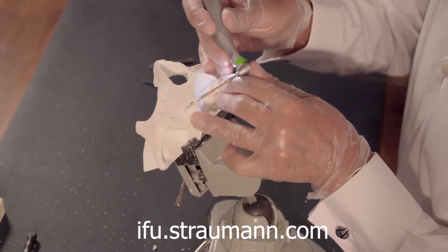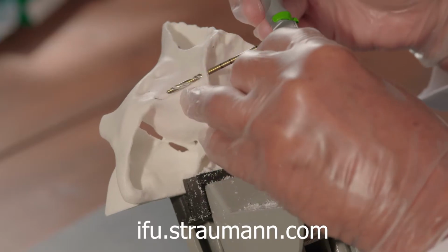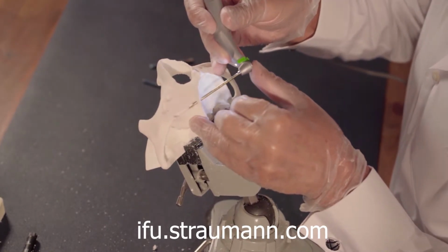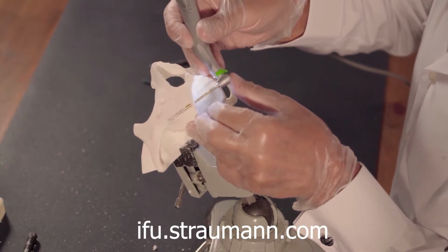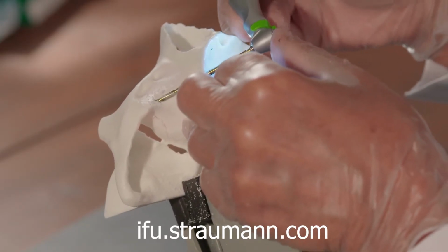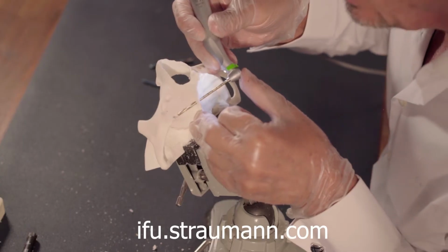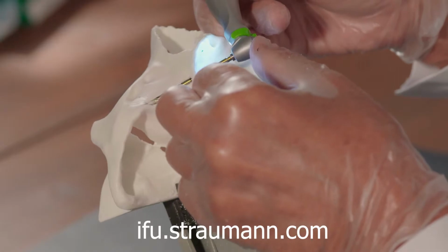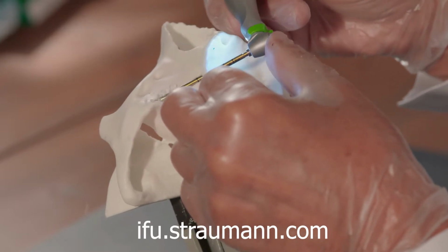Now you see the drill should flow. You shouldn't feel any difficulty in sliding the drill. So the drill goes in, out, very smooth. Every 4 seconds you take out the drill for irrigation to occur, because it is quite difficult to hold the drill there. You don't want the bone to be hot there. So 4 seconds, out for irrigation, 4 seconds, out for irrigation, and again.